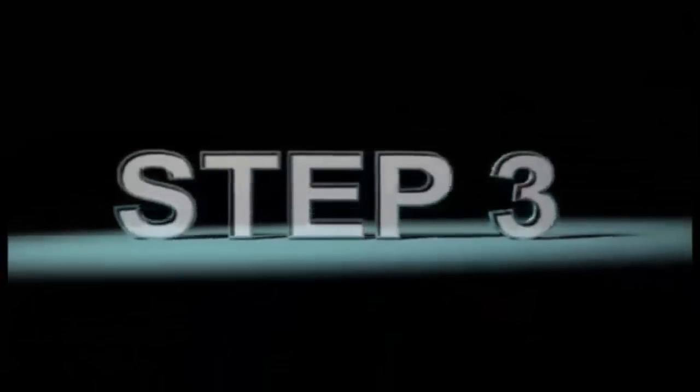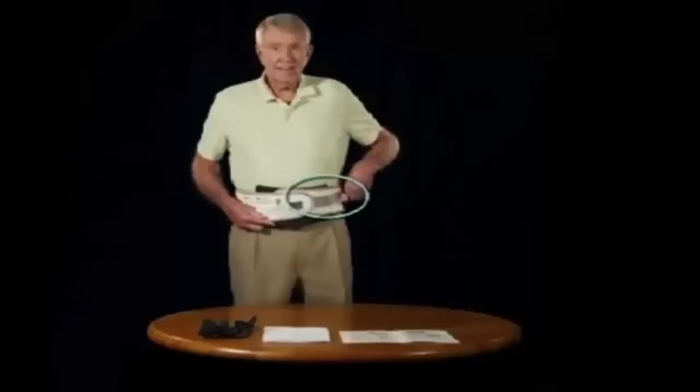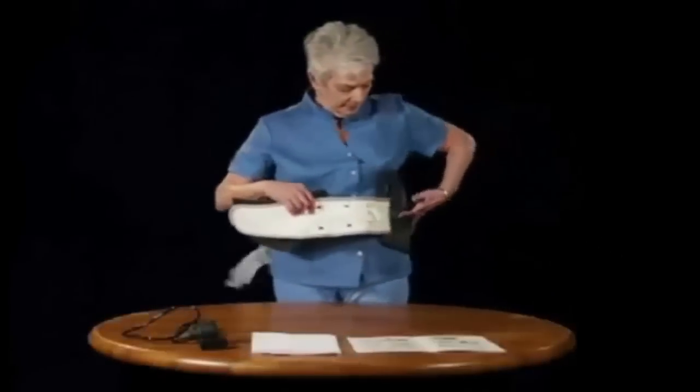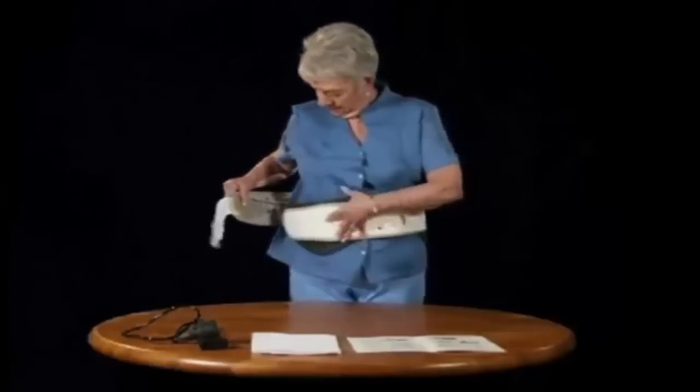Step 3. Tightly fasten the other Velcro strap. The Traction Belt should now be positioned between your hip or pelvic bone and your rib cage. The Traction Belt should fit snug and secure as well as comfortably.